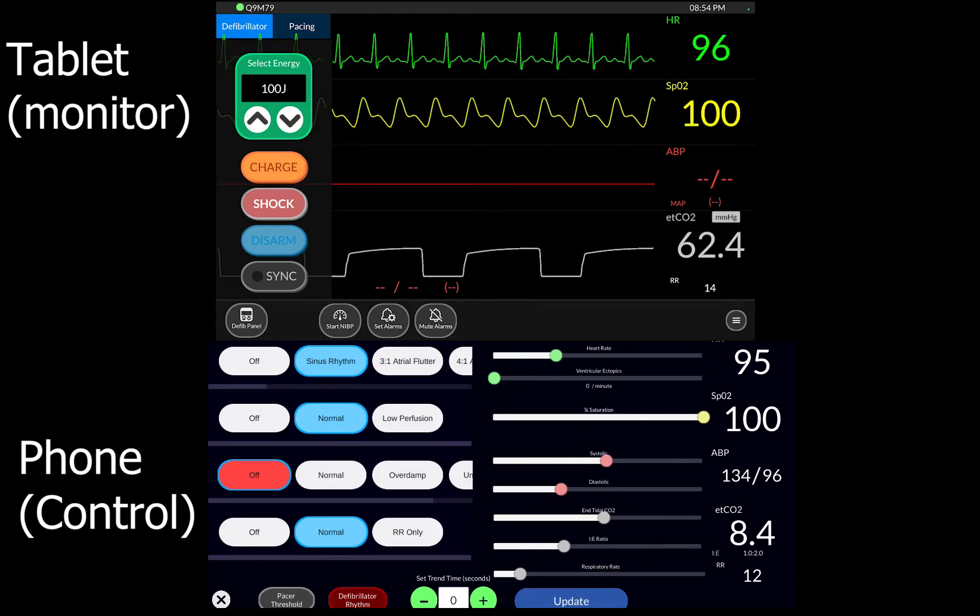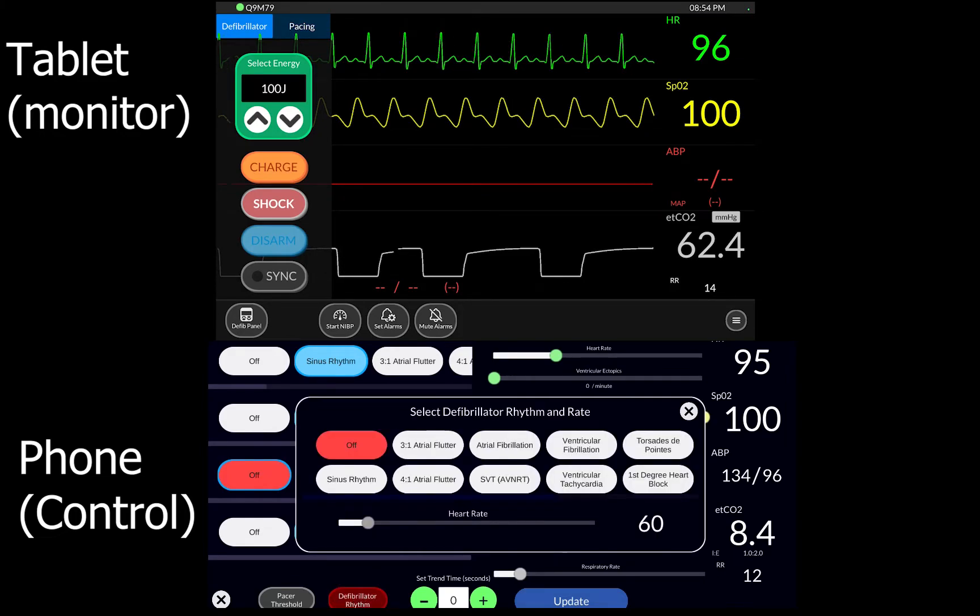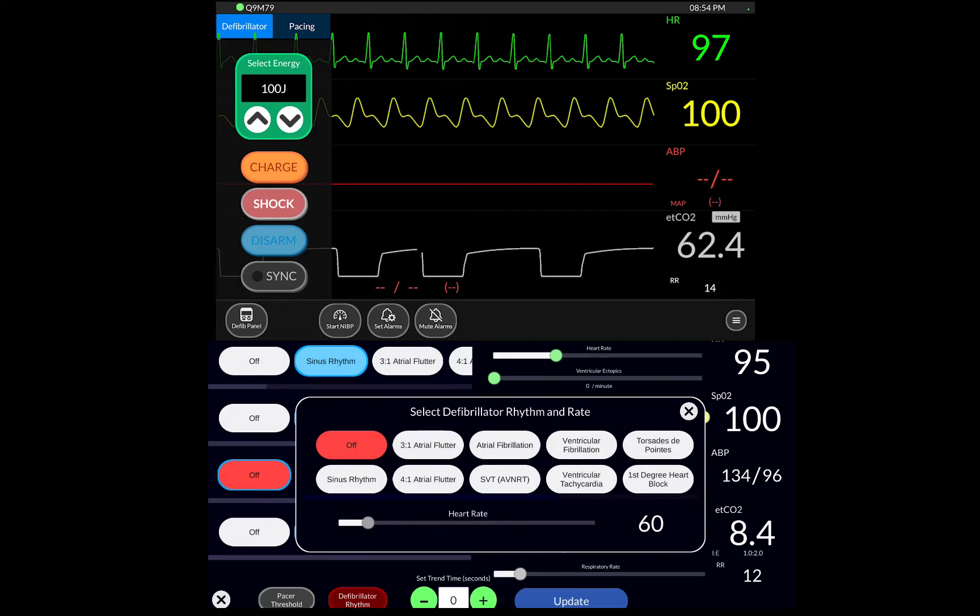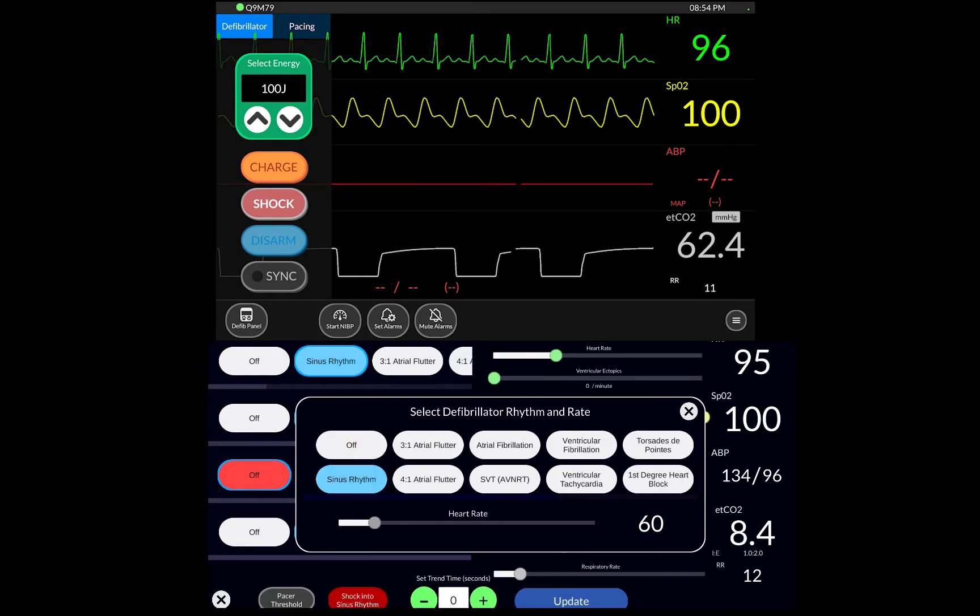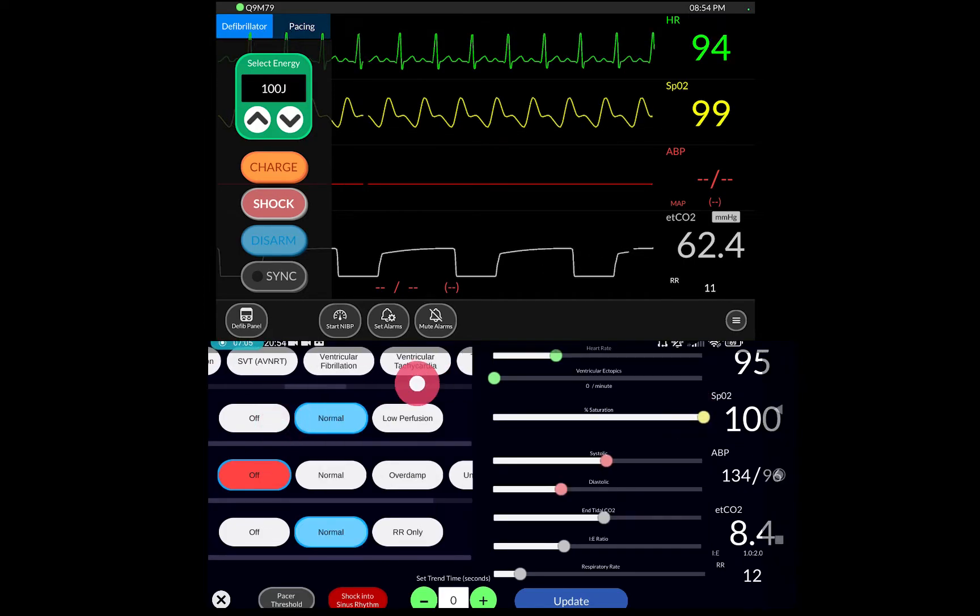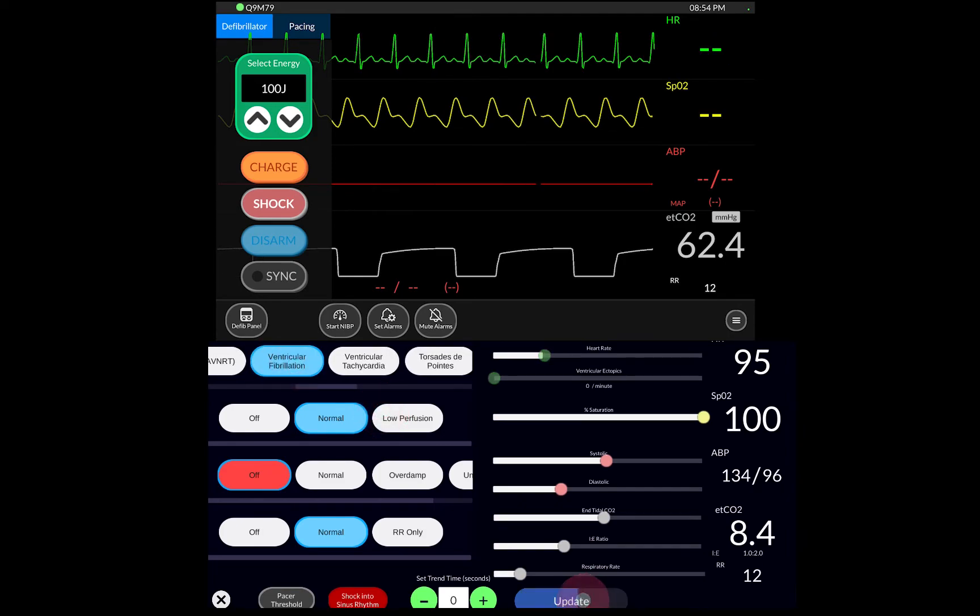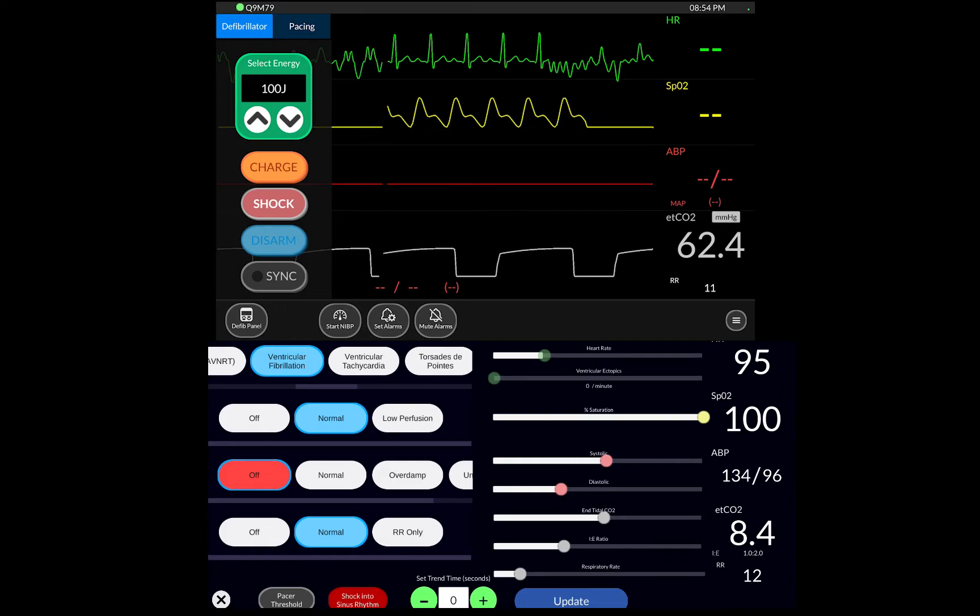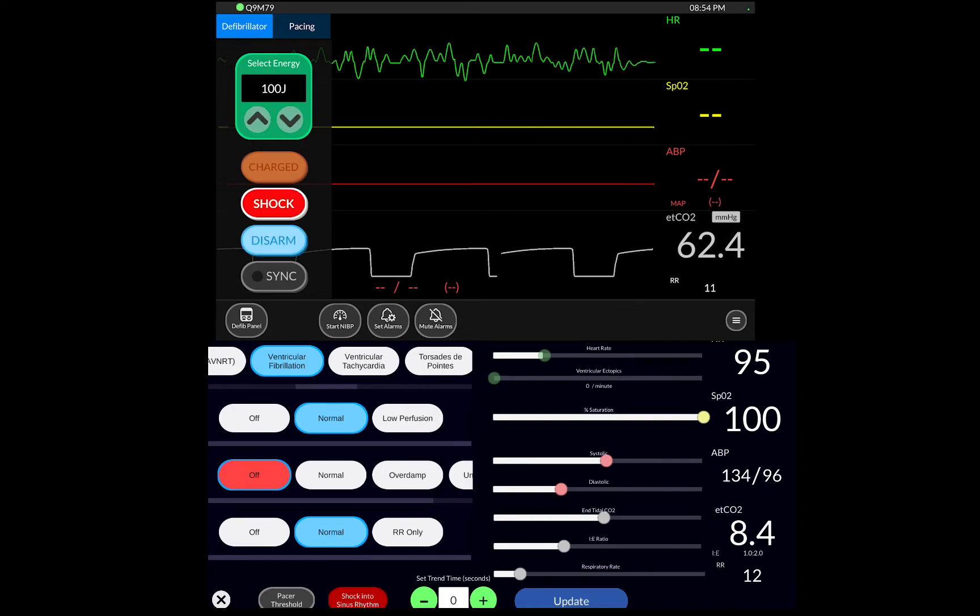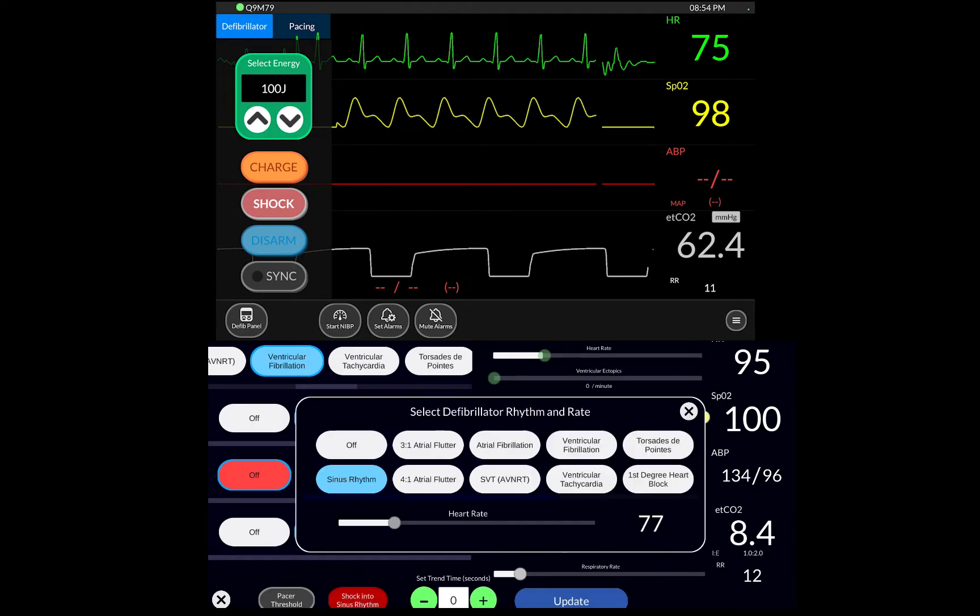And then if I want to on the phone, I can go to the defibrillator rhythm. So I can set this to a normal sinus rhythm with a heart rate of 77. And then I can change this to a shockable rhythm with ventricular fibrillation. If I update that now, you see on the monitor it's gone into VF. And so if I charge and shock, it'll go into a sinus shock and it's now shocked into a sinus. So you can choose which rhythm you want it to go into.